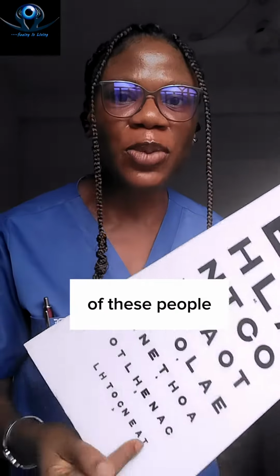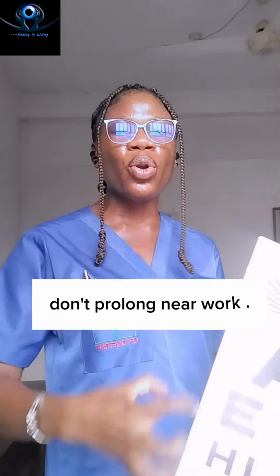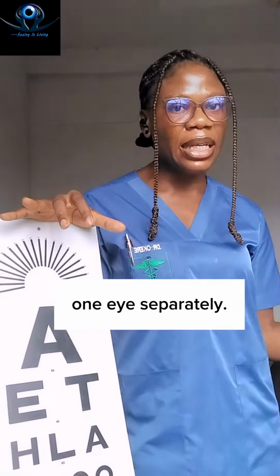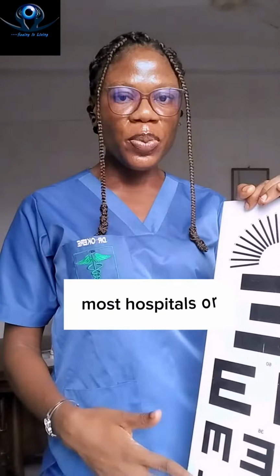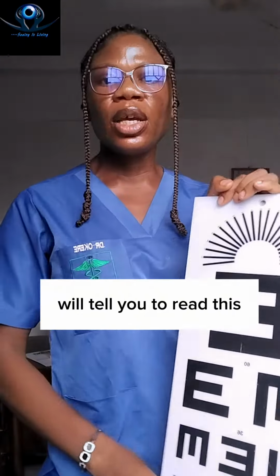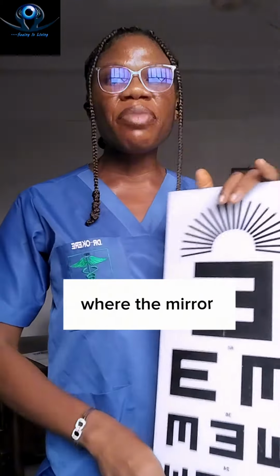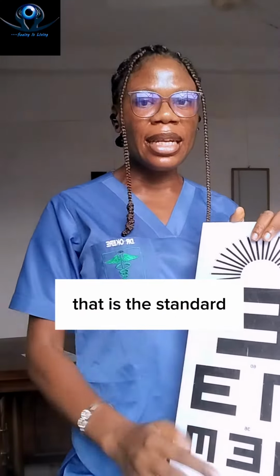The major problem of these people is usually asthenopic syndromes like tiredness, pain, tearing, especially when they have done prolonged near work, which can be an indication of their eye overworking or over accommodating. This clinical examination is usually performed one eye separately. So your right eye might read only A, which is 6/60, while your left eye reads A-E-T, which is 6/36. Most hospitals or eye clinics with smaller space, not equivalent to 6 meters, will tell you to read this through a mirror, and this mirror is usually placed 3 meters away from the chart, where the mirror helps to create an extra 3 meters, which will make it up to 6 meters. That is the standard for this eye examination.